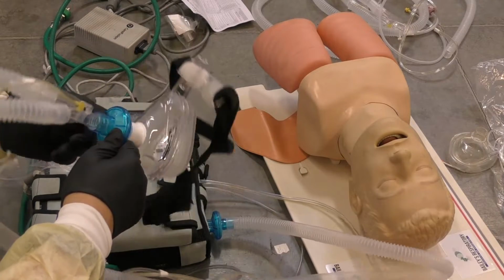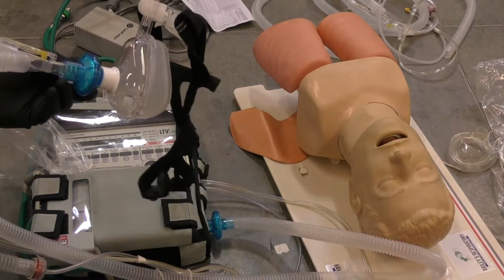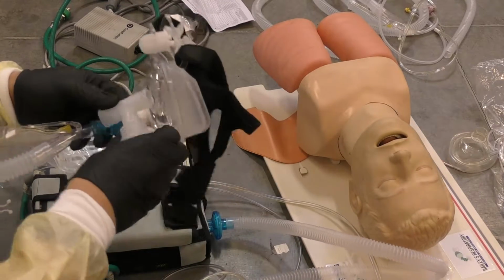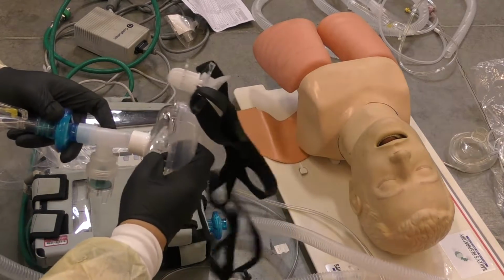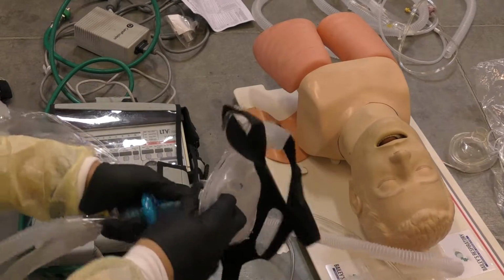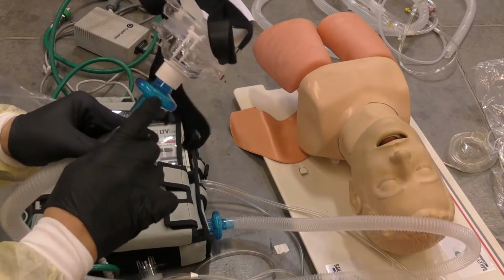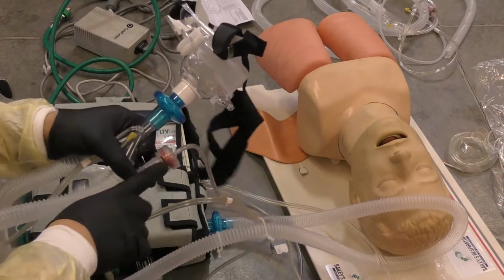And we're not using nebulizers on these COVID patients. But if you do have a patient who doesn't have it, you could still put a neb in line. You just have to make sure that whenever you put a neb in line, you put it in front of the filter. Just common sense: you don't want to medicate that filter. But again, not for COVID patients. We've got our filter in line here, and we're protecting everyone with this.